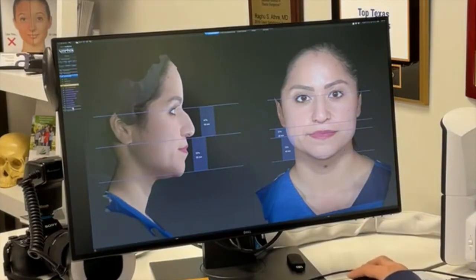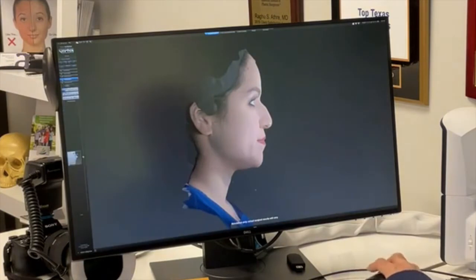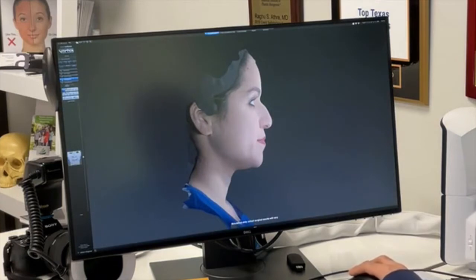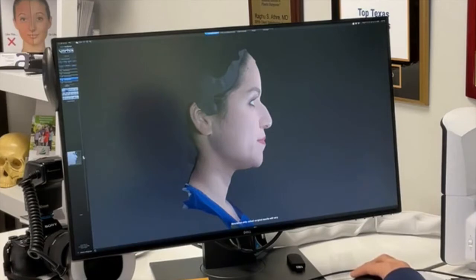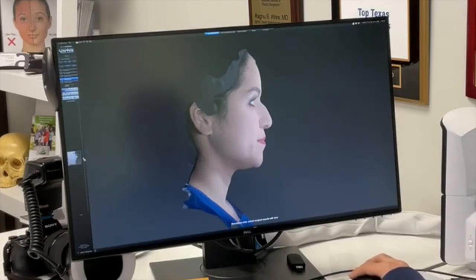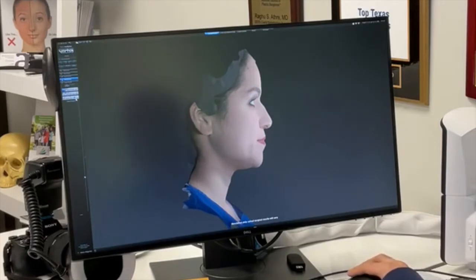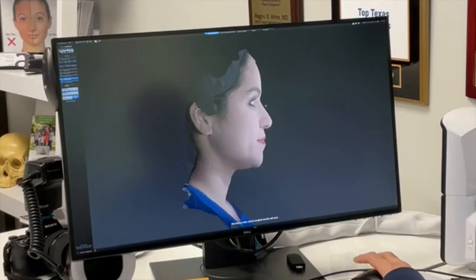The coolest thing about this program is that we can model changes. Let's do a rhinoplasty on her — one way is to use the slider tool to adjust the dorsum. You can see me adjusting the dorsum, and for further fine-tuning I have the capacity to circle a specific section and bring that down a little bit.